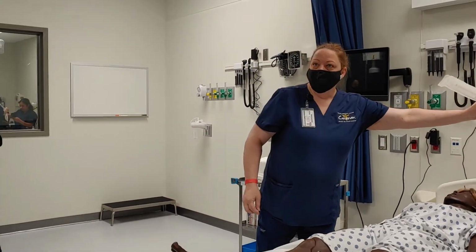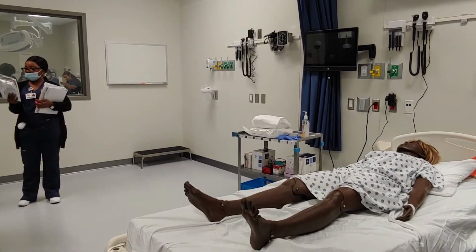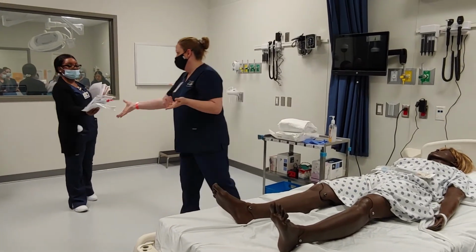So is it kind of like an enema? Yeah, so you know when you drain it? Instilling something. Yeah. With this one, we're removing it.